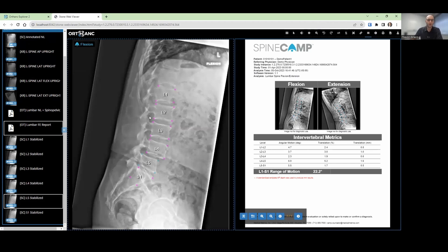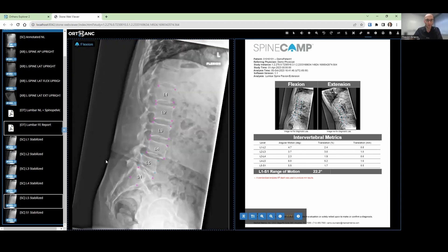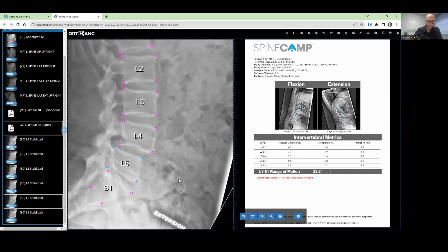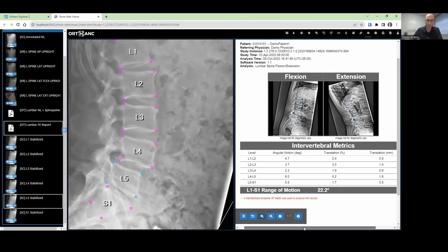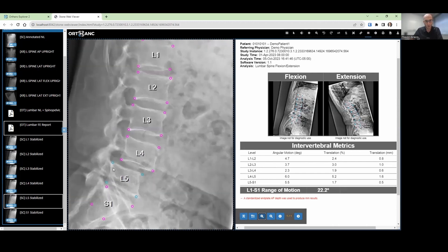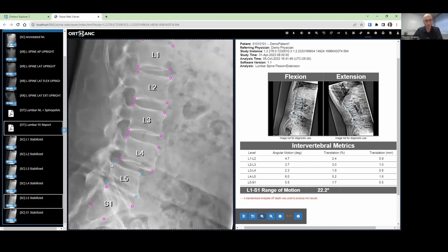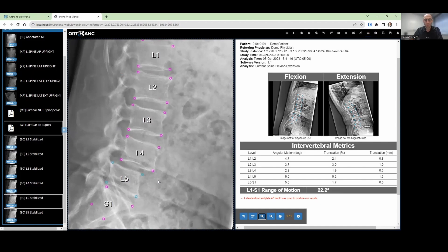What we have here on the left is what we call a stabilized series. What that means is that a vertebral body — L5 in this case — has been registered between flexion and extension. You can see me toggling back and forth; this is a simple flick of the mouse wheel going between flexion and extension. You can very clearly see the motion that is occurring at L4-L5. Everything is properly labeled for analysis, transparency, and explainability. All of the calculations on the right are derived directly from these landmarks and the registration at L5. L5 is what we call stabilized — it is held frozen in place between flexion and extension, providing a reference point to clearly visualize the motion at the level above and below the stabilized body.